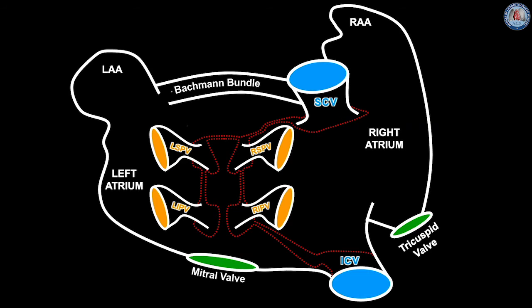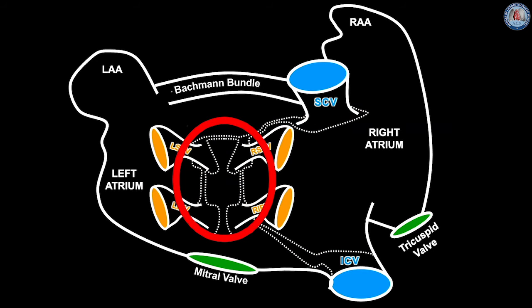This is a scheme of the atrium that allows you to show the different lesions that can be performed with a hybrid AF ablation. First of all, we believe it is of paramount importance to isolate the box together with the 4 veins and the ligament of Marshall. When using a bilateral approach, you can also isolate the superior caval vein. And when you are doing patients that have had several catheter ablations or paroxysmal AFib, it might be of importance to also isolate the superior caval vein.